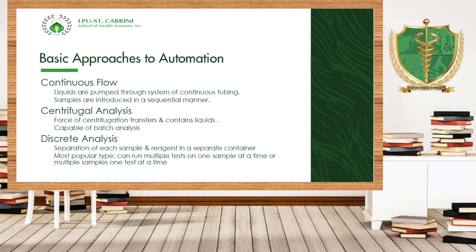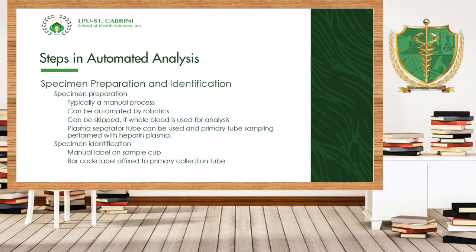Discrete analyzers offer random access or stat capabilities, like we said in the past slides. This is the most popular and most versatile analyzer nowadays because of its sophisticated features.